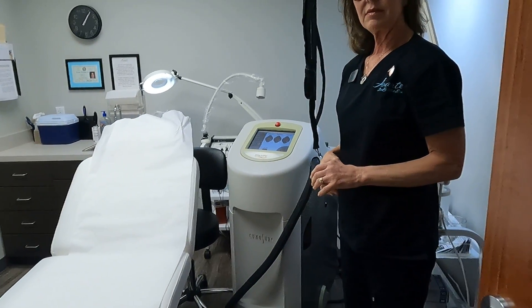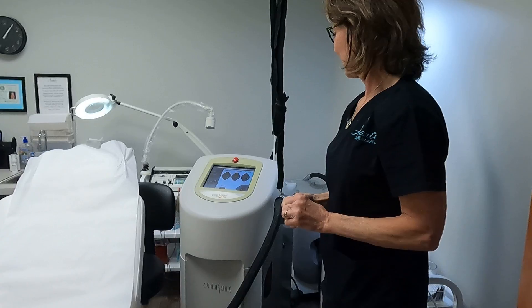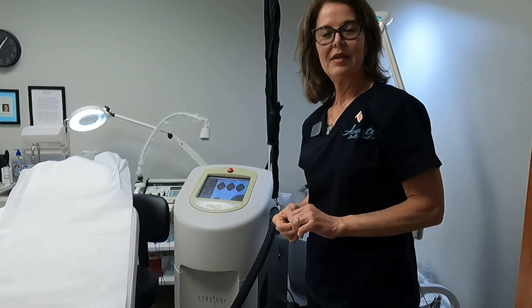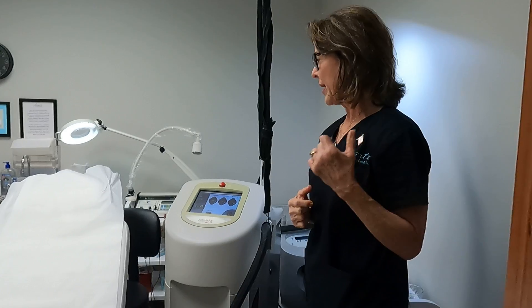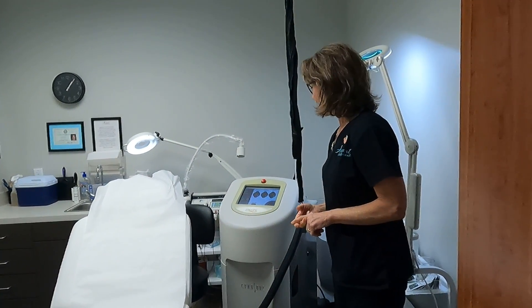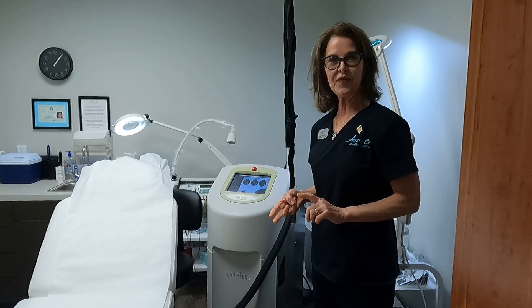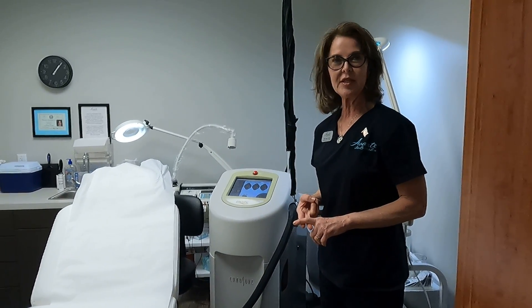With Mary Ann here at Avante, she's going to tell us a little bit about the Cynosure Elite MPX. So you have a couple of lasers for hair removal. As we just talked about, the main difference between the Candela Gentlemax Pro and the MPX Elite — same two wavelengths, the 755 and the 1064 — but the main difference between these two devices is the method of cooling.